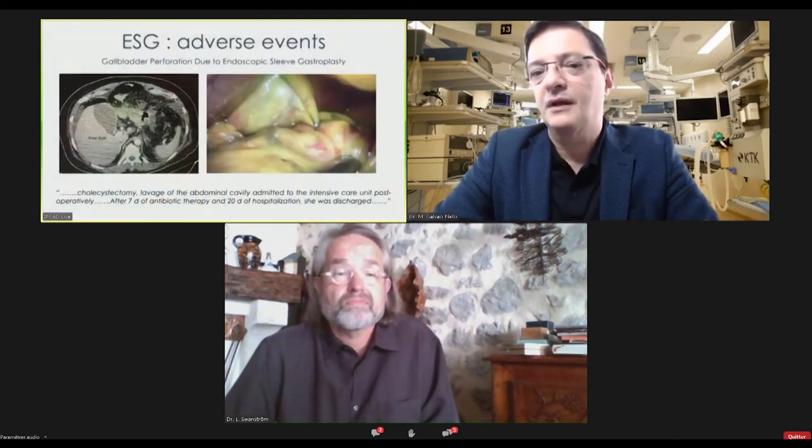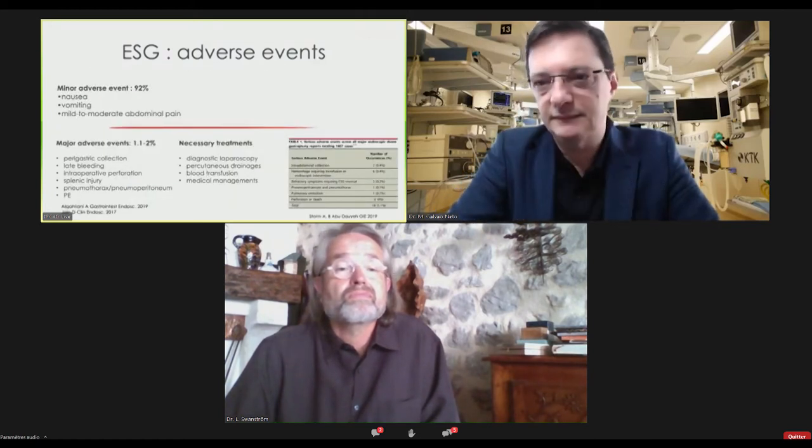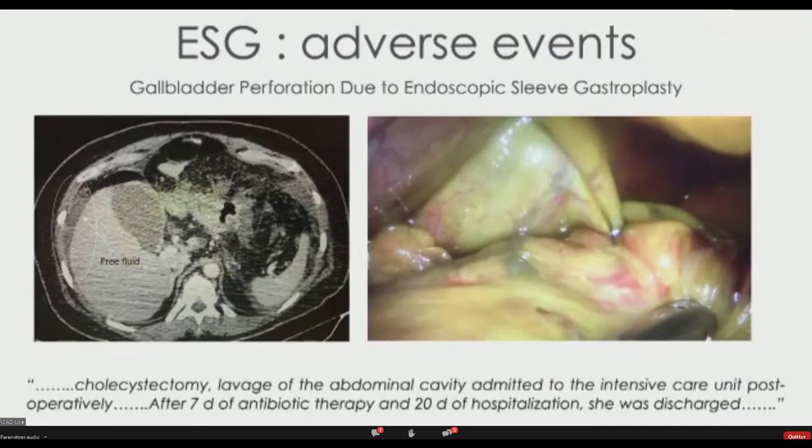I have, for example, the question of the position of the patient. Yes, thank you, Bernard. This is what I was showing at the beginning. If you can, yes, the one before that or after is showing the CT scan. So this is the complication rate, and you can see that this is a very, very safe procedure, and much safer than surgery. And the more you do it, the more experience you have, the safer it is. But to me, one thing is very important, and I said it at the beginning: if I can have the next slide, it is really the position of the patient.